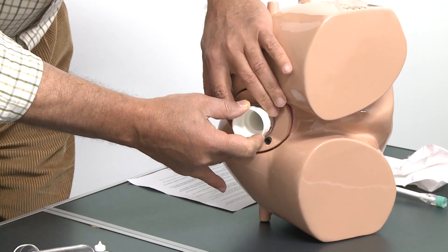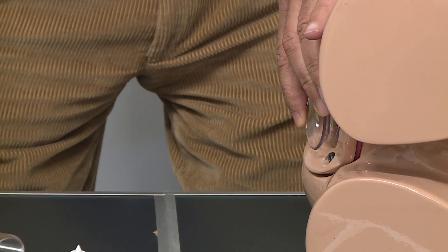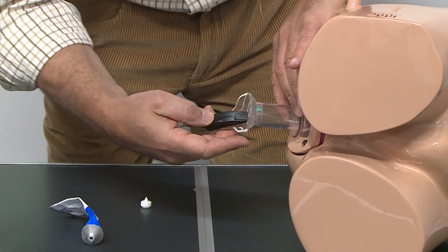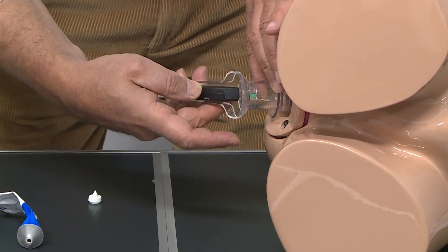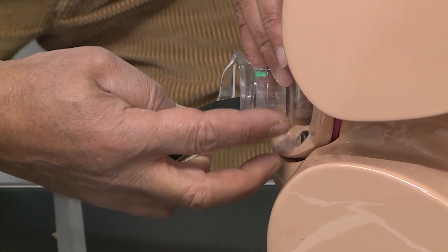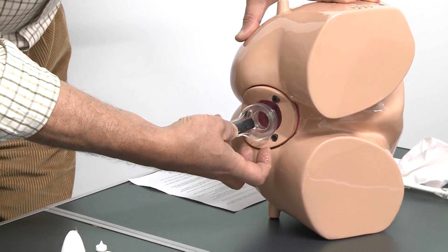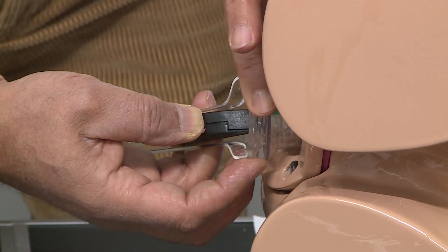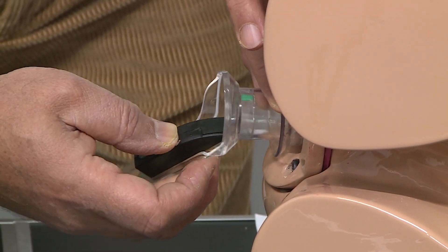After putting that in, we hold the sleeve and take the trocar out, then we introduce the body of the scope. There is a locking mechanism which is very helpful in holding the scope inside the sleeve. If we like to take it out, we can just twist it to unlock it.